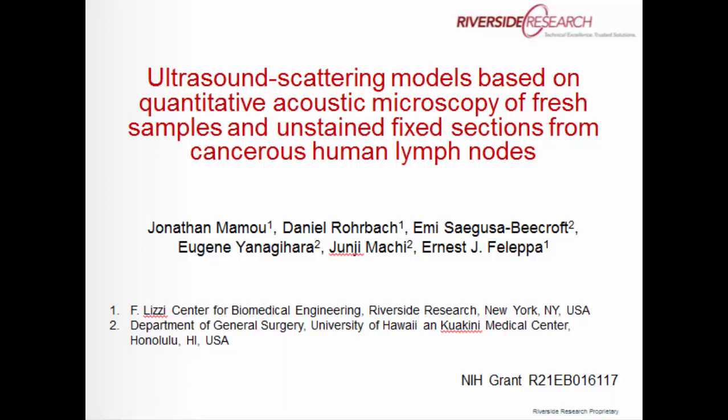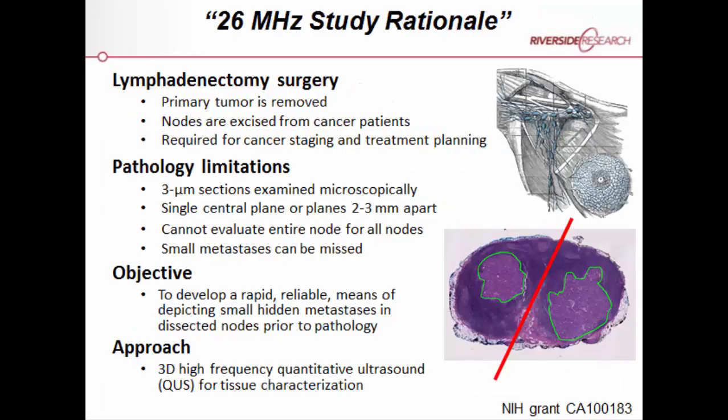So this is a project that's been ongoing for about 2.5 years, and we're trying to do acoustic microscopy to basically analyze lymph node data at lower frequency, but still high frequency. And you might have seen me talk about that 26 megahertz study. It's a different grant. It's been ongoing for 9 years already. And it's looking at finding cancer in lymph nodes.